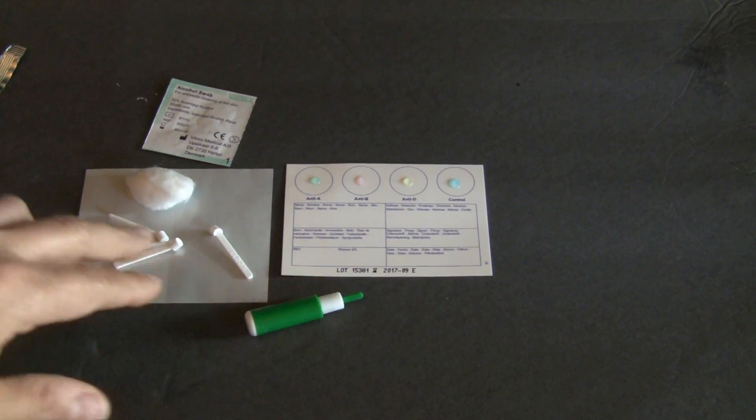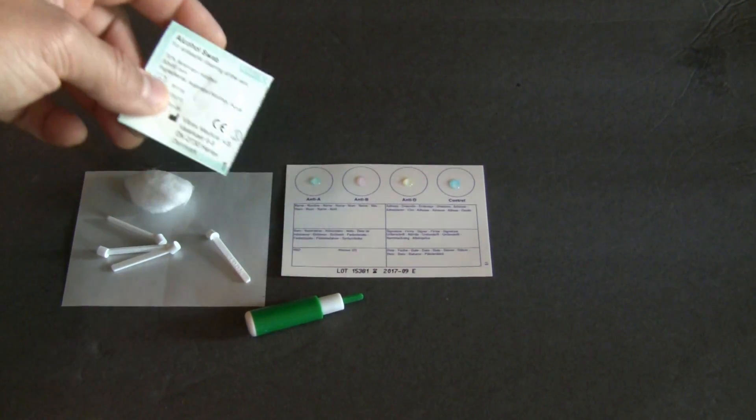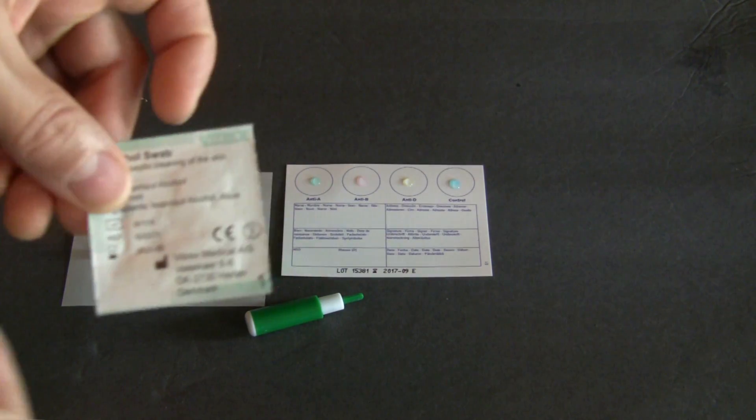Now we have the lancet, the four Eldon sticks, the cotton swab, the alcohol swab. It's about to get real in a minute.